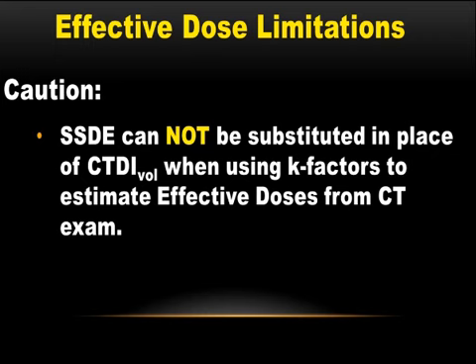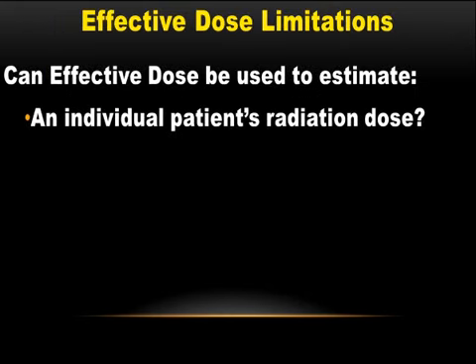Because essentially the K factor is a bridge that takes you from simulated organ doses in phantoms back and forth to the CTDIvol. And of course, that simulated phantom and organ dose didn't change just because we figured out a better way to estimate patient dose. So these K factors are not appropriately used with SSDE values.